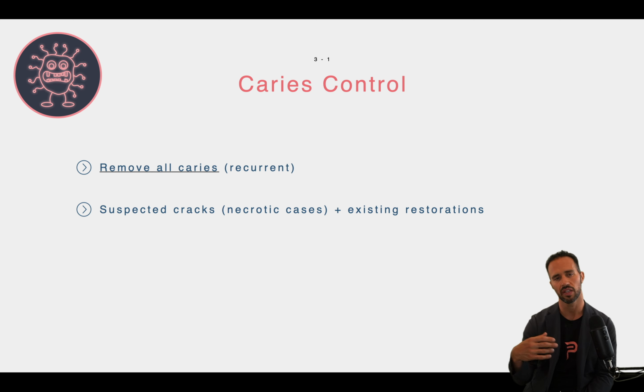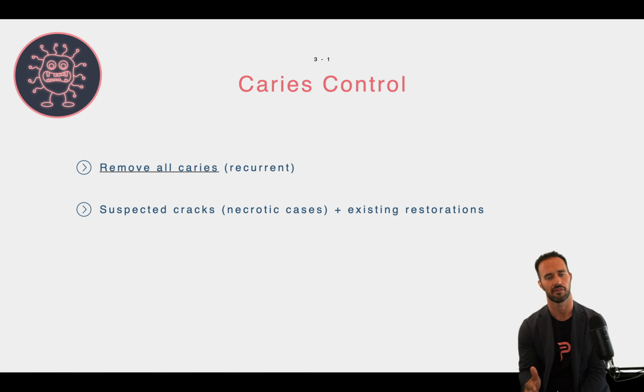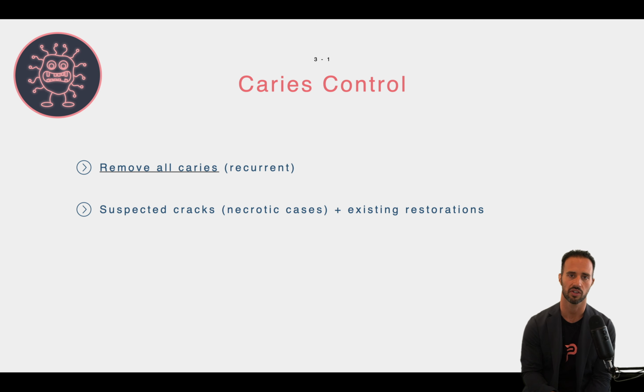You don't want to get really deep into a case and then discover, oh, look, there's a crack here, and maybe the tooth doesn't have a good long-term prognosis, and we're going to abort the procedure. You want to find out those kinds of things very early in the procedure so that the patient isn't undergoing anything unnecessary, number one, so you're not wasting chair time.